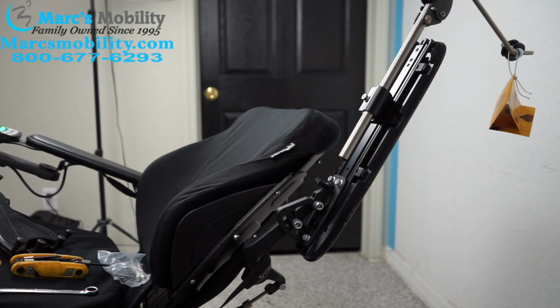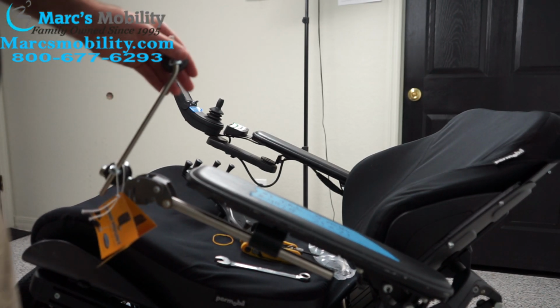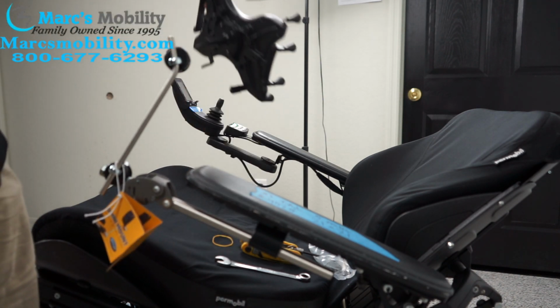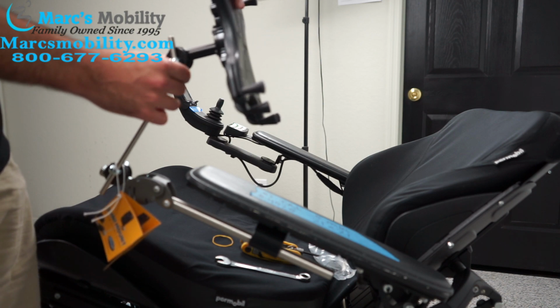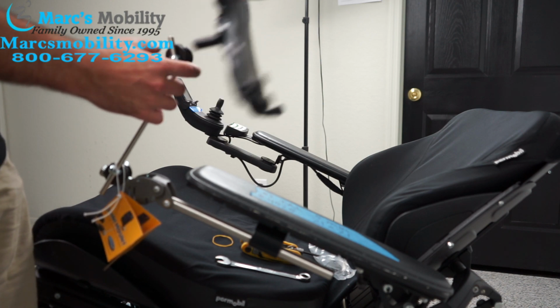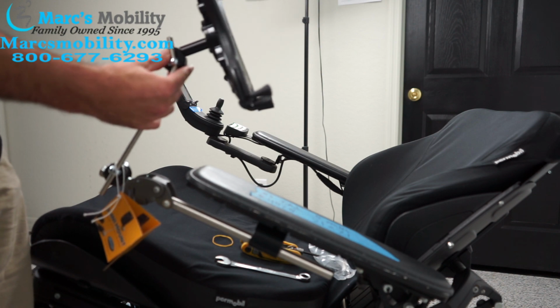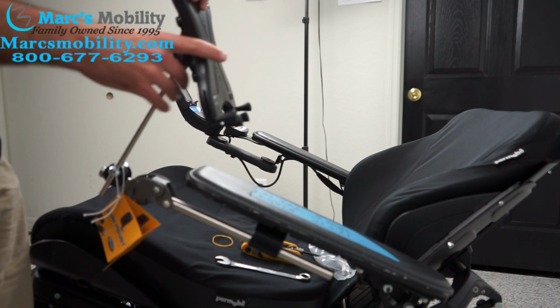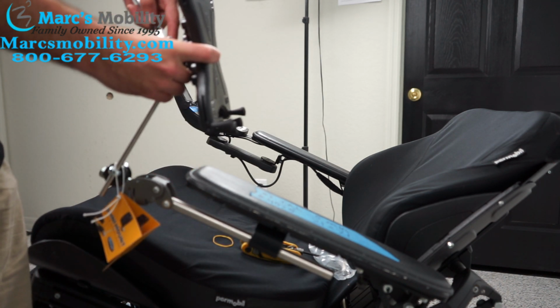So I'm going to tilt this down. There we go. And in order to mount this, this little post here will go in through this hole. And it is loose because we loosened this nut on the other side. So that's going to mount in there. And then with our 1/2 inch wrench on the other side, we're going to tighten that nut again.